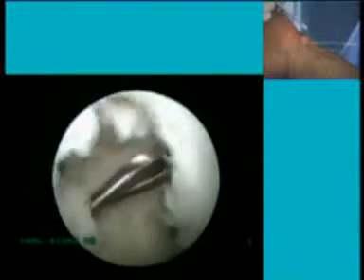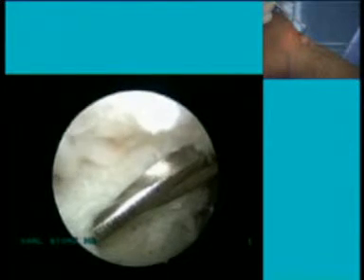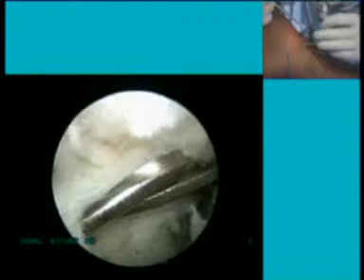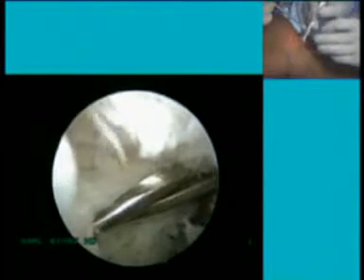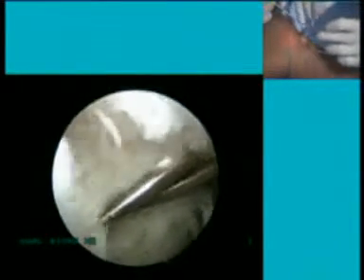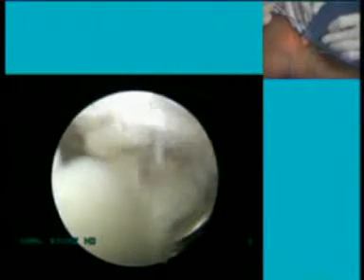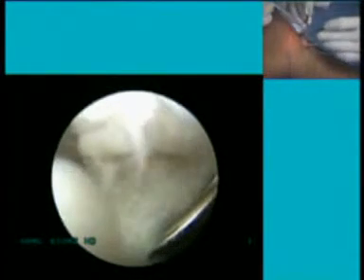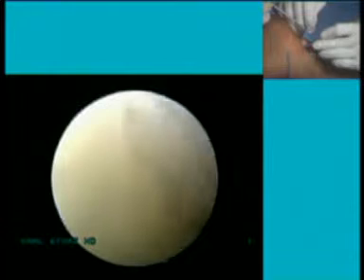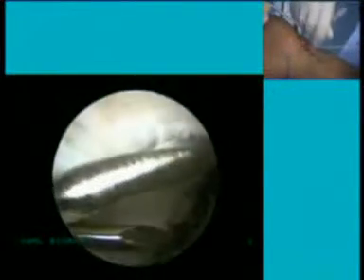So what fixation method would you be using for both the tunnels, Dr. Peterson? At the femoral side, I will use extracortical fixation. I use a FlipTack, which is like an EndoButton. And at the tibial side, I use the interference screw, bioresorbable, the Megafix screw, and then you can use either two buttons to do a backup fixation, or you can tie a knot between the two sutures over the bone bridge, which we have here at the tibia side.